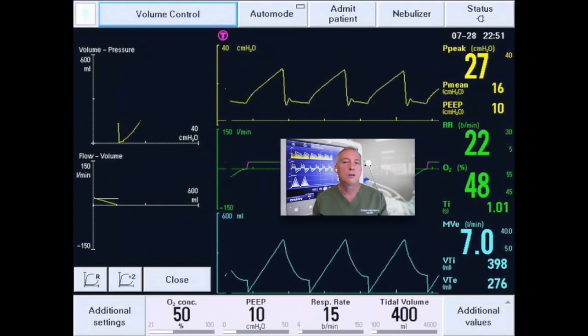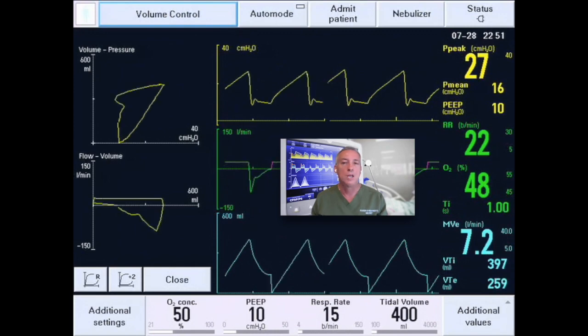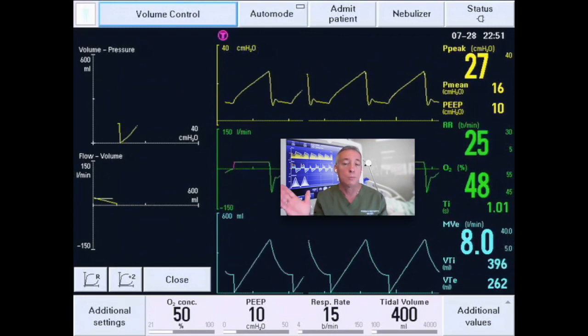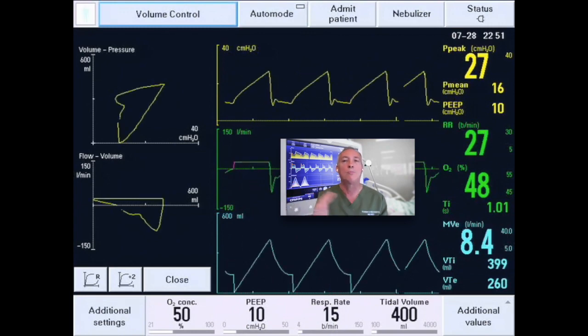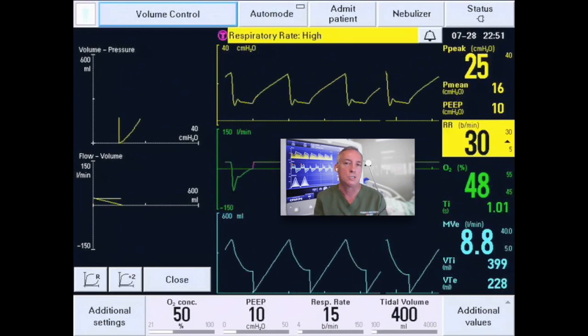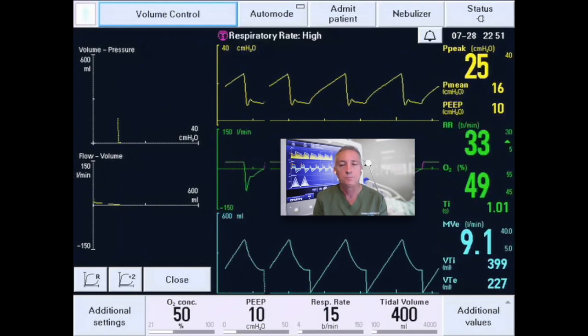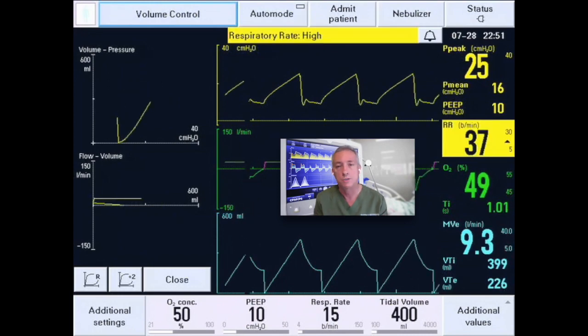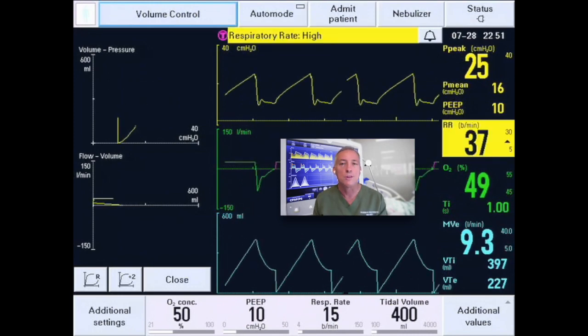While it is very tempting to change the sensitivity setting, to increase the number so you make the ventilator less sensitive to patient effort, that will be just a temporary solution. You need to find out exactly what is causing the auto trigger. If it is a leak, like a bronchopleural fistula, as a respiratory therapist you are not going to be able to do anything about it. You may, in this case, make the ventilator less sensitive by going up in the number until you find a good solution. Otherwise, the ventilator is going to auto trigger.